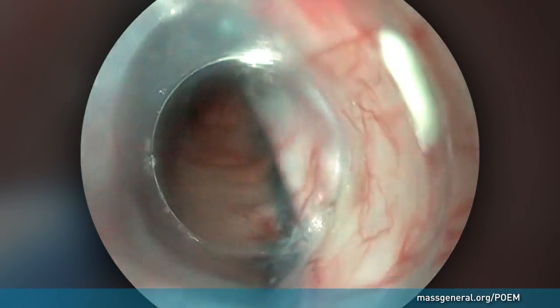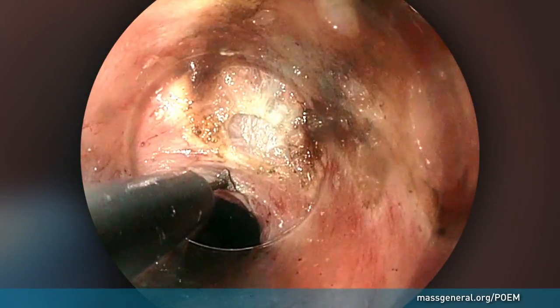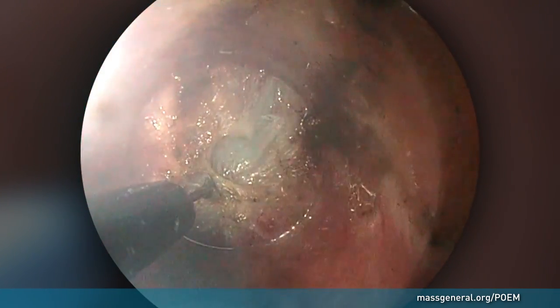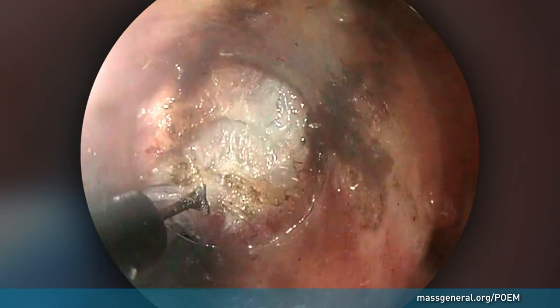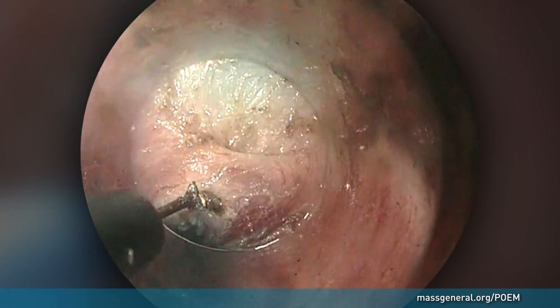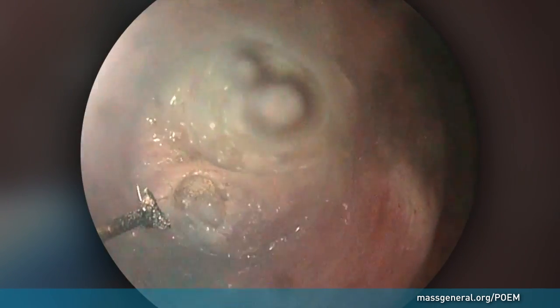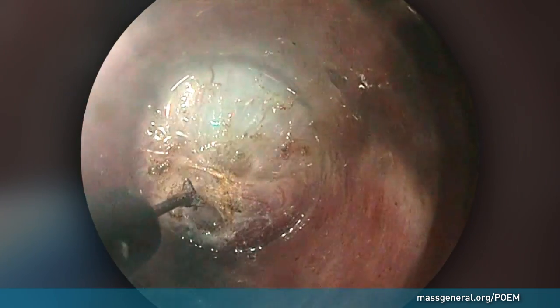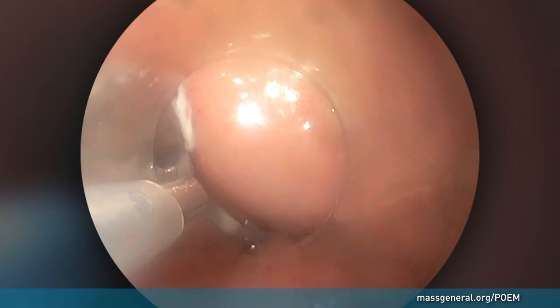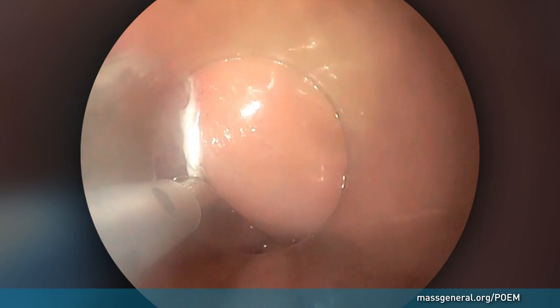The endoscope is reinserted into the tunnel to the lower esophageal sphincter. Here the surgeon begins to divide the muscle fibers that obstruct the normal digestion process — this is called a myotomy. The myotomy is performed through cauterization, which continues to the end of the tunnel the doctor created. After viewing the entire tunnel area to confirm that it is open and intact, the entry to the tunnel is closed with small metal clips.